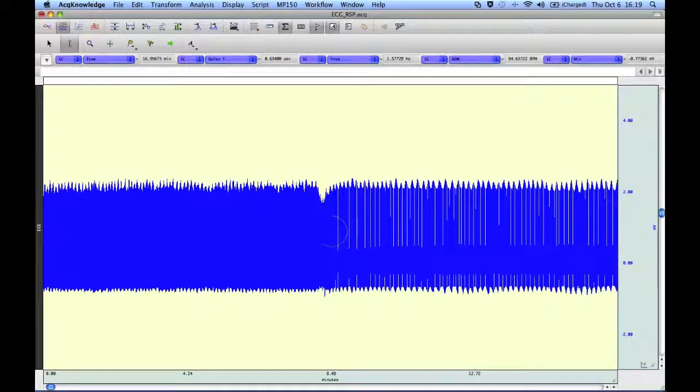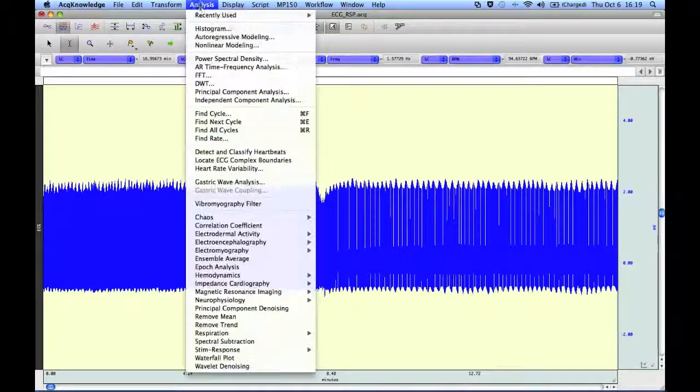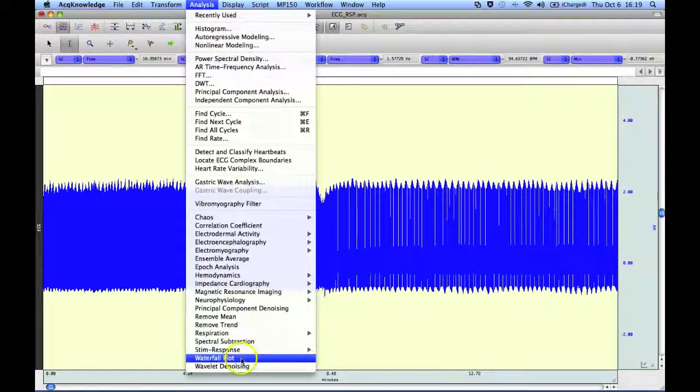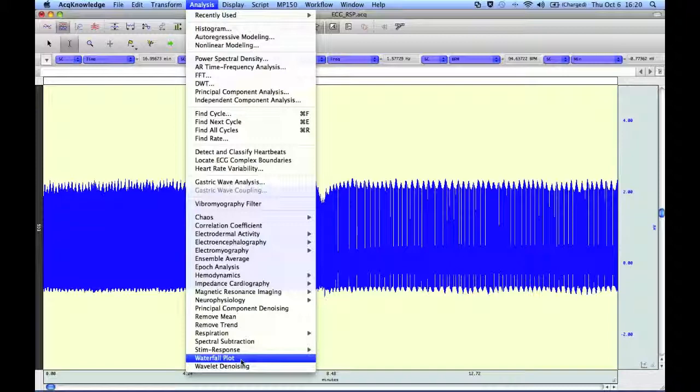Anyway, that concludes our demonstration of the Acknowledger waterfall plot routine.